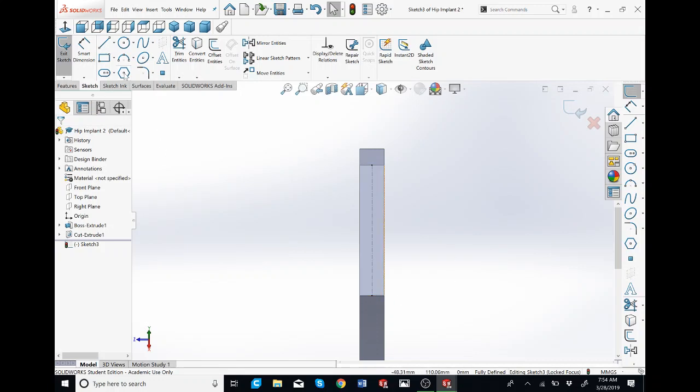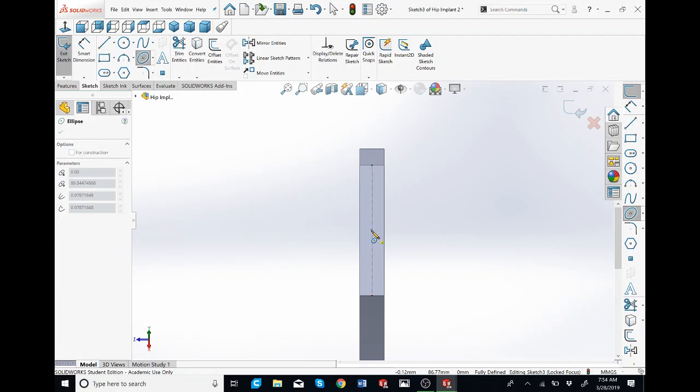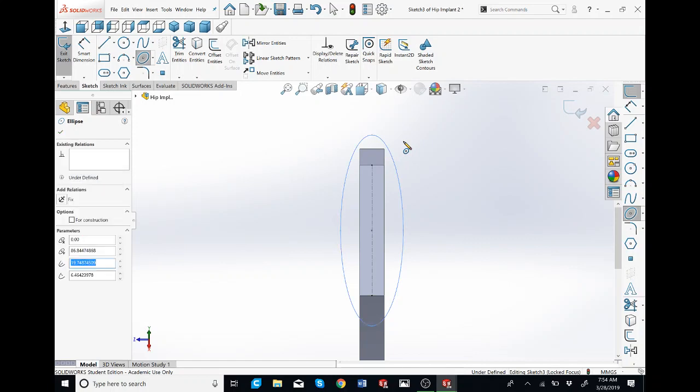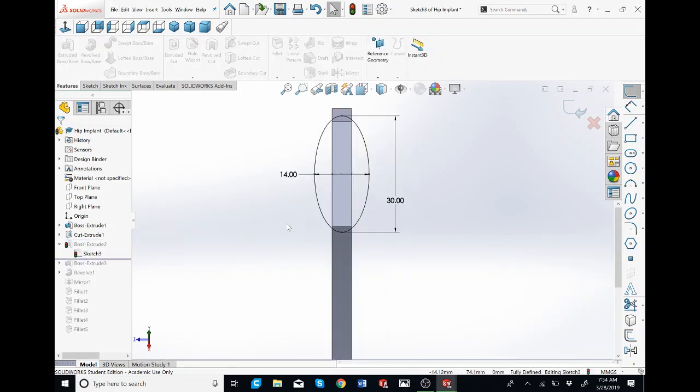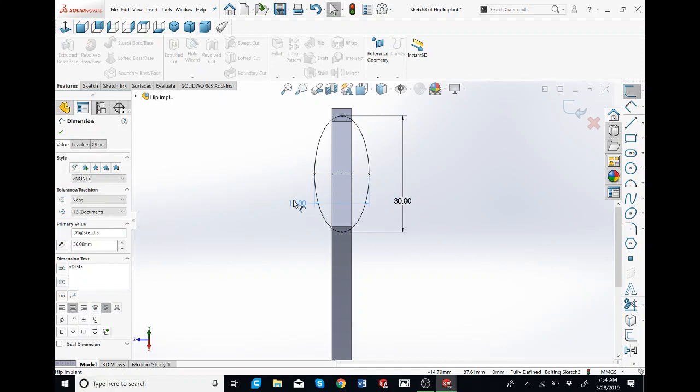I'm now going to do an ellipse. And I'm going to hover over the center line to get the center point. I'm just going to bring it up, click it once, and then click over here, move to the side, click, and then escape to get out of it. So dimensions are 30 and 14. I have the center line here, you could do it going from this edge to this edge, it doesn't really matter, I just wanted the center point.